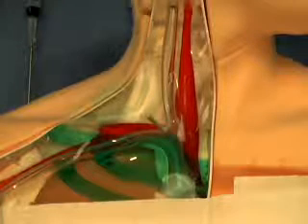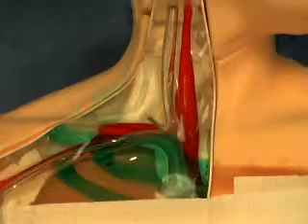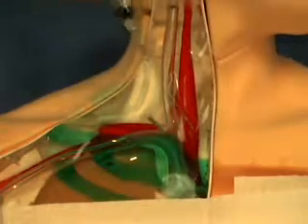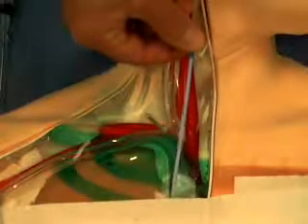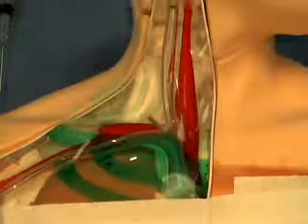The ultimate patient safety behaviors related to major vascular injuries are: 1. Use of a short, small finder needle. 2. Limit the depth of either the guide wire needle or the dilator. 3. Being conscious of the direction in which the vein travels when advancing either a guide wire needle or a dilator. And finally, understanding these patterns of major vascular injury.